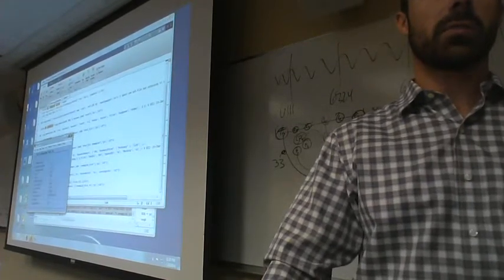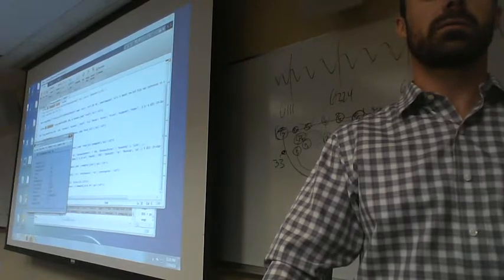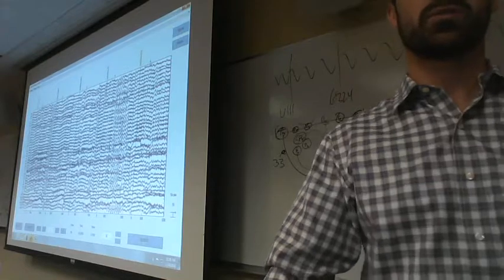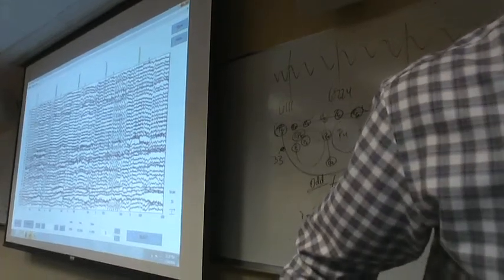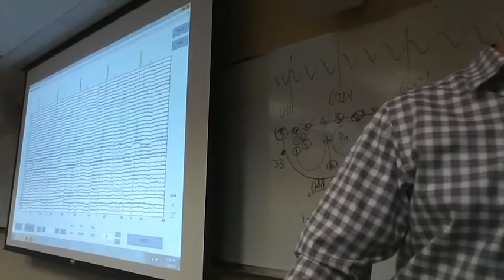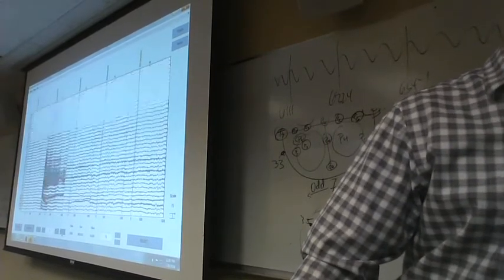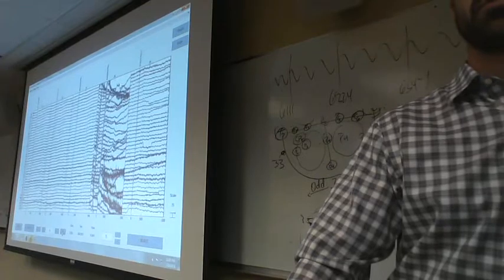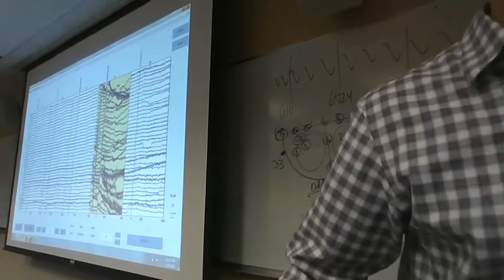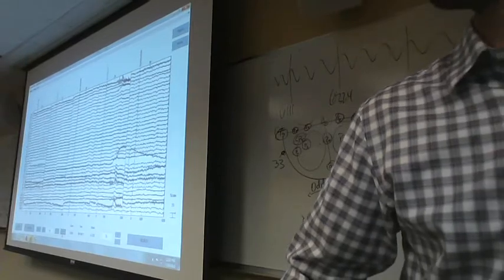So now that we have our epochs, we can plot the channel, scroll through it, and we see these different epochs. We talked about this a little bit last class, so hopefully this will bring us back to where we were. Yeah? And what was your range again? Sorry? I did -500 to whatever. So here's some noise, huh? -500 to about 1500. I'm still working on the script thing.